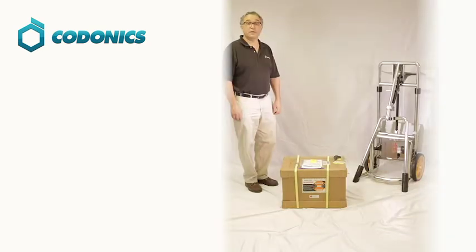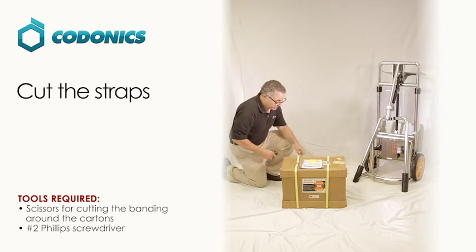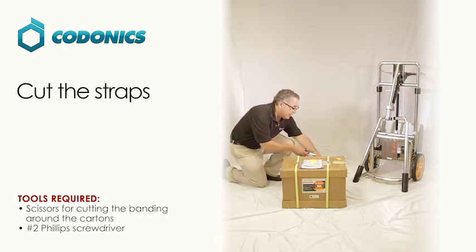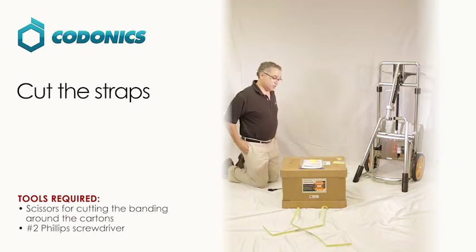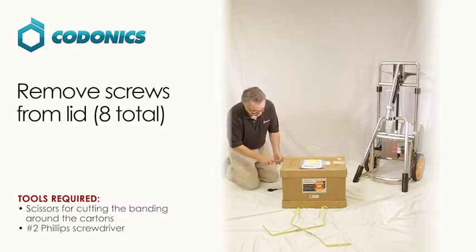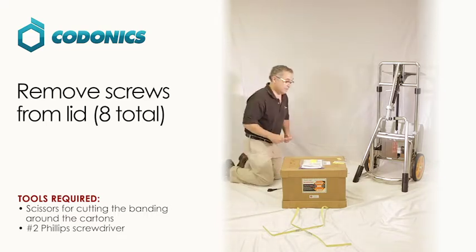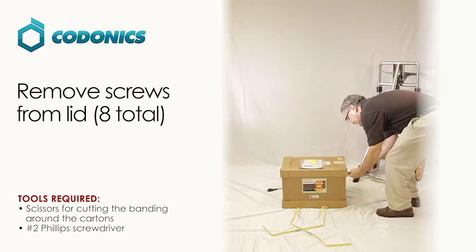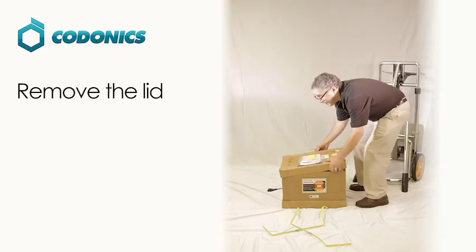The next part of the Codontics digital portable x-ray bundle is the x-ray device itself. You need to open up the box, get a pair of scissors, and cut the banding on the back. Then take a screwdriver and unscrew the screws on the side. Take the top of the box off.